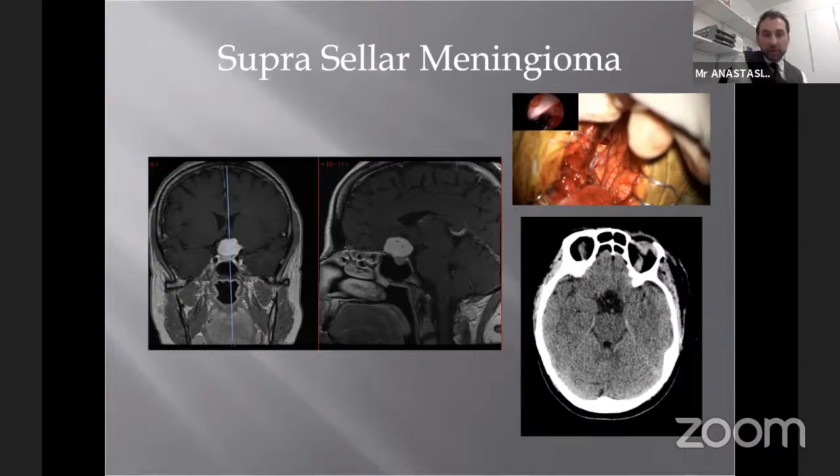We removed this recently through an eyebrow supraorbital mini craniotomy, complete resection. You can see on the top picture the left optic nerve, with a 45-degree angled scope visualized from below, confirming no residual tumor. It's a grade 2, so it needs close radiological surveillance, despite that it has been completely debulked.